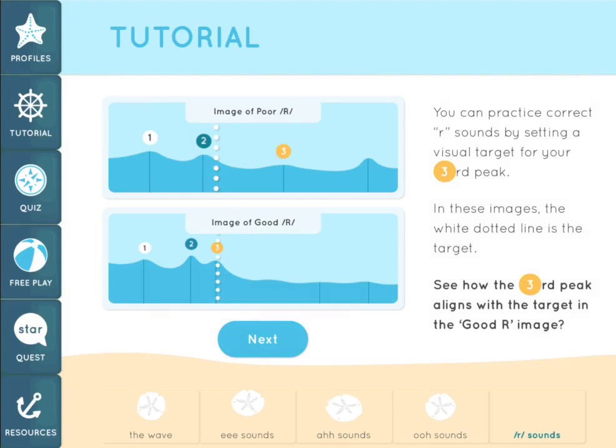You can practice correct R sounds by setting a visual target for your third peak. In these images, the white dotted line serves as a visual target. Note how the third peak aligns with the target in the good R image. Lining up the third peak of the R sound with the visual target will be the goal in Visual Acoustic Biofeedback Therapy using START.